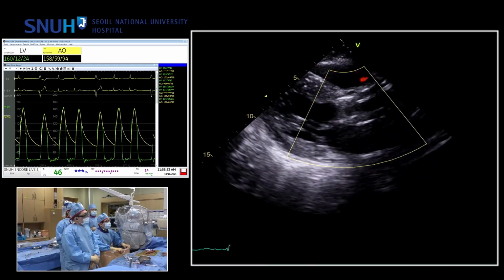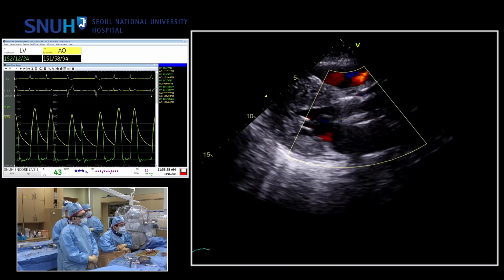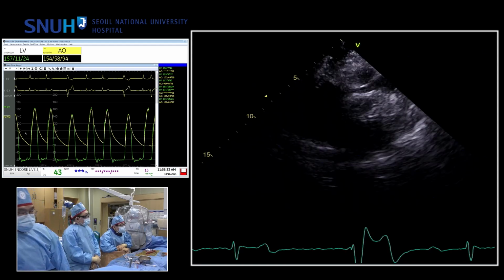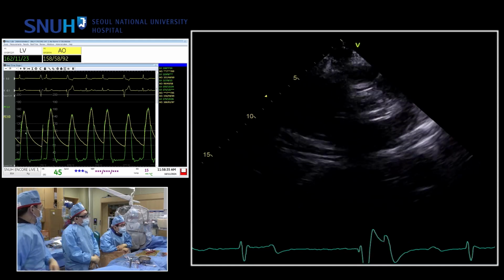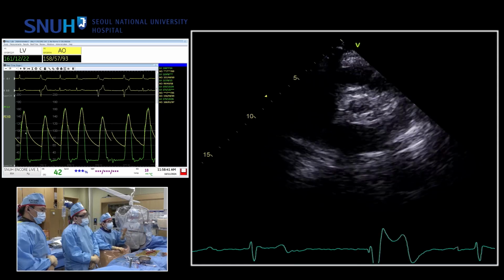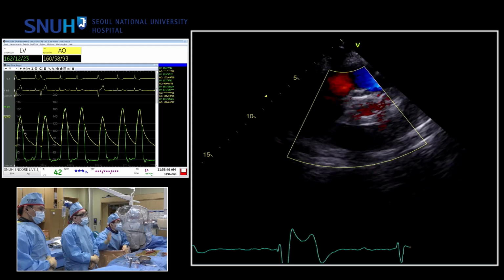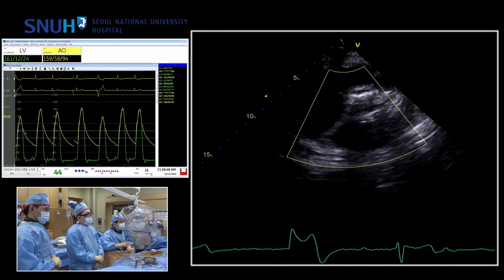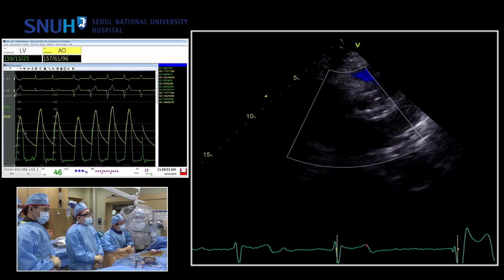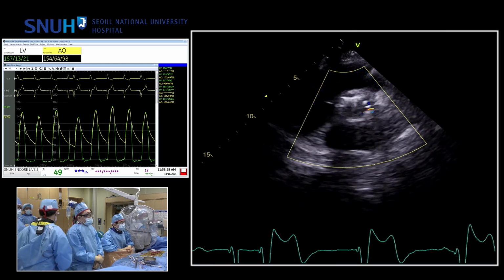Okay. We don't need an imaging specialist in the TAVI procedure because we are already accustomed and trained to see the image with our hands. Thus, it is very difficult to recruit image specialists at the time of TAVI procedure in all hospitals in Korea because all doctors are very busy. Thus, I'm not sure your system is ideal. It's not practical. Okay?